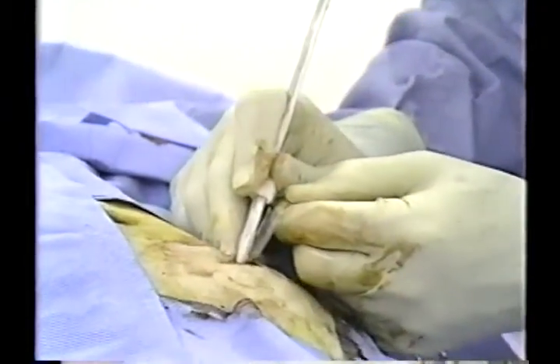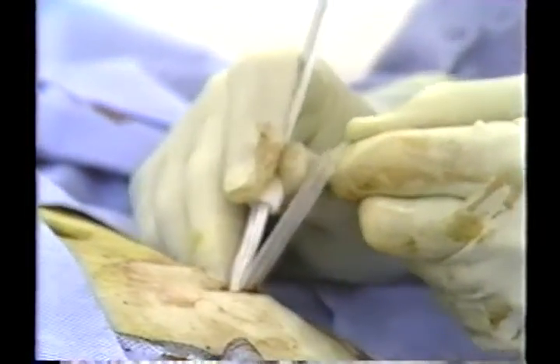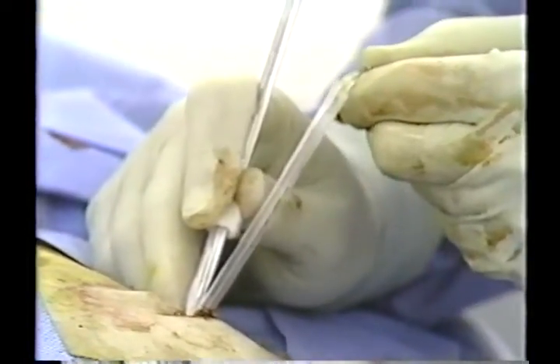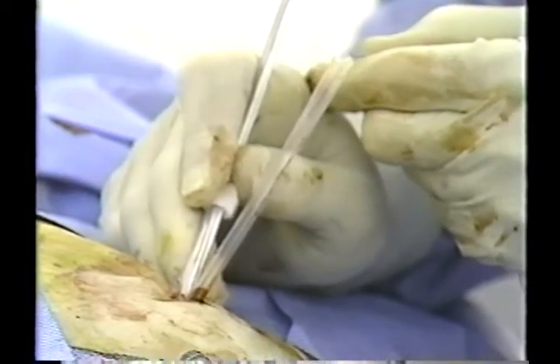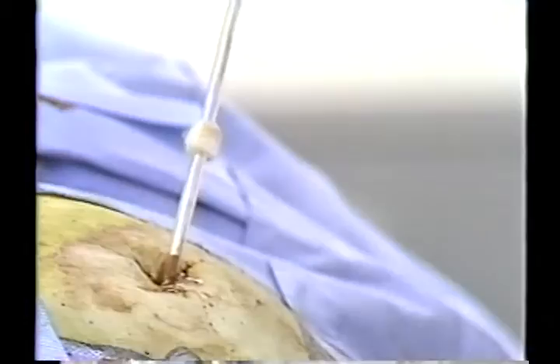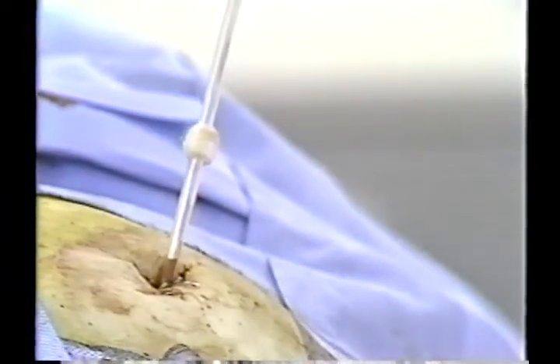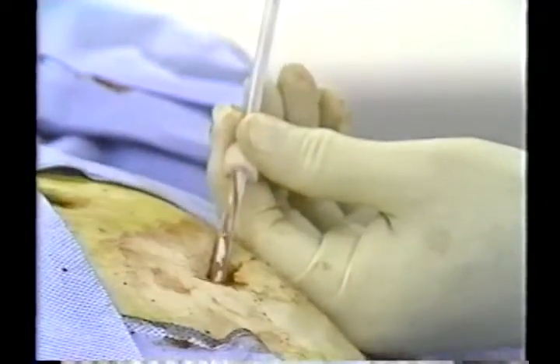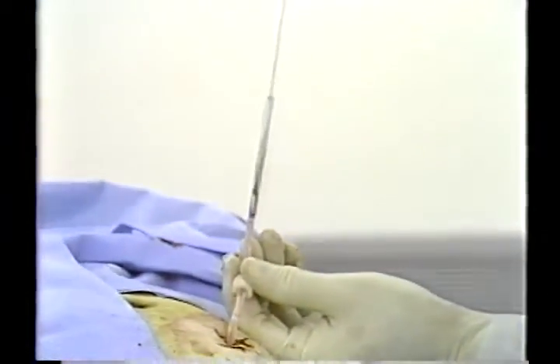The quill catheter guide is then removed while the stainless steel stylet holds the catheter stationary. The slit in the quill catheter guide allows it to widen around the catheter without affecting the catheter or cuff position. The stainless steel stylet is then carefully removed from the catheter, leaving it in the original confirmed visual position.